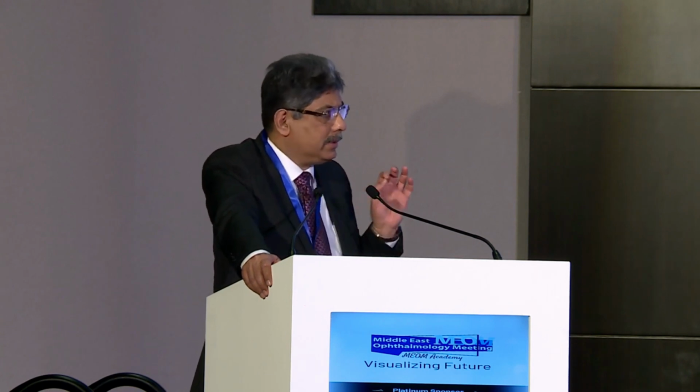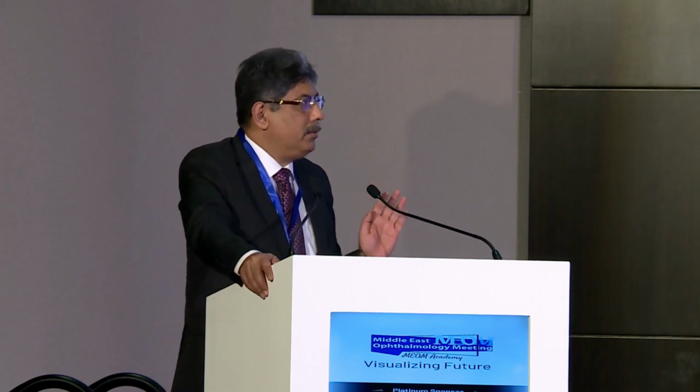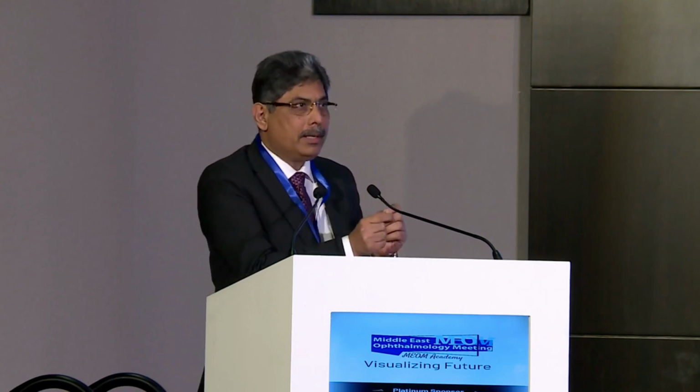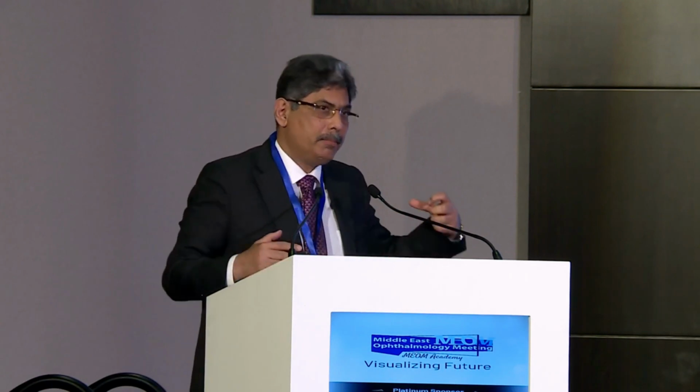But when you see the PC rent, you should not panic. You should be very cool, calm, and composed, see where you are, and stay there itself. If you are able to complete the phacoemulsification of that piece which is engaged at the tip, you continue with it. But then immediately stop and push the viscoelastic from the second hand. This is very important, and this is the way we should go ahead.